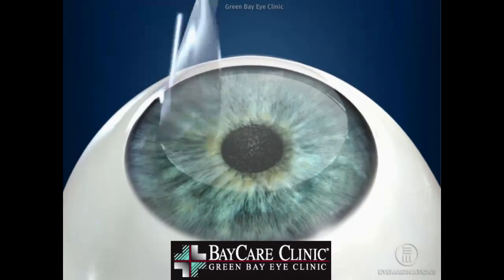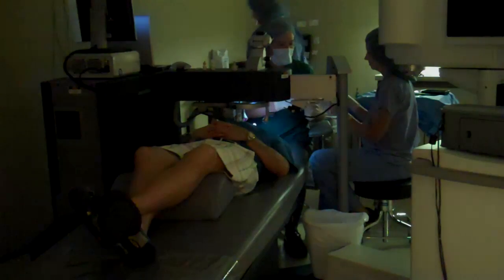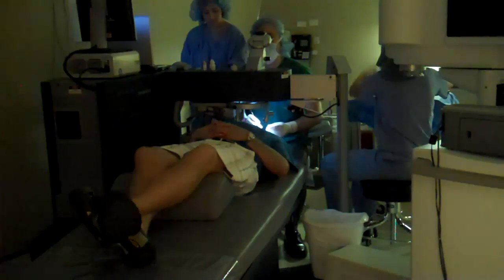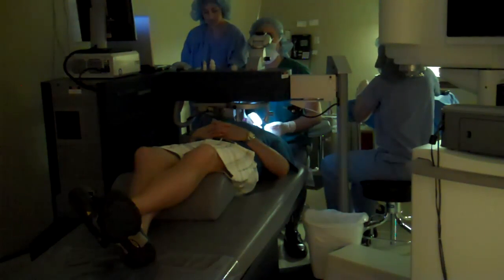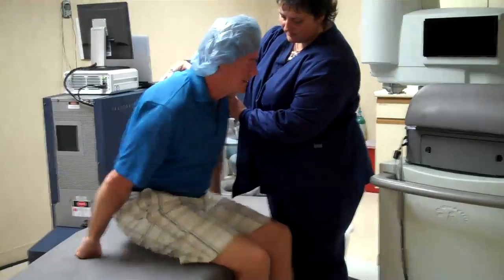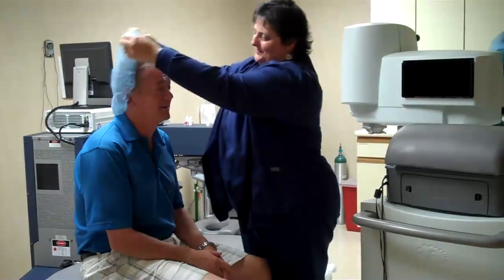Once finished, then that flap is repositioned and it's smoothed into place, making sure that it is properly aligned. The right eye is done first and immediately followed by the left, where the same procedure is performed. When finished, we then have the patient sit up, hopefully enjoy the fact that they are seeing better already, and bring them to an exam room so they can be looked at and given instructions.